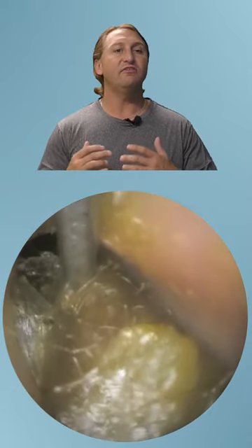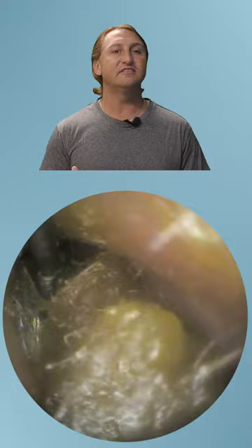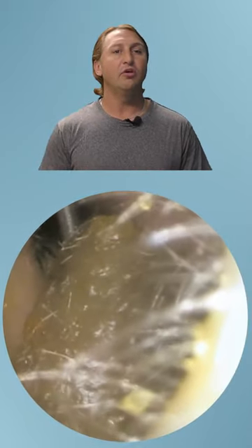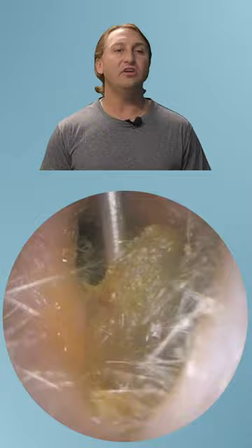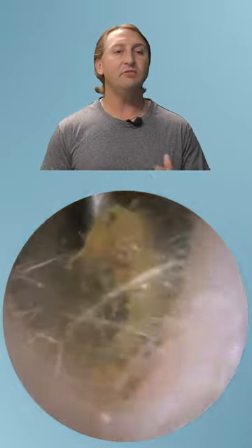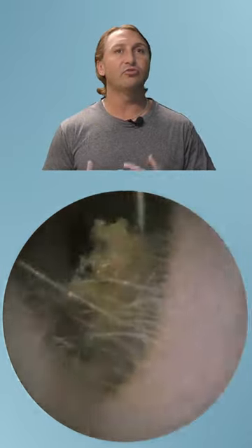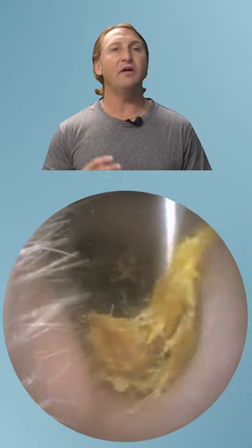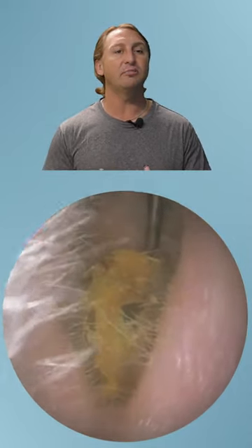This earwax is a very different texture and consistency. It's not really soft and gooey, but it's also not really hard and firm. It's kind of an in-betweener. The outside layers, the curette went through really easily, but they seem to be getting snagged and held up on that inside plug that the patient has.